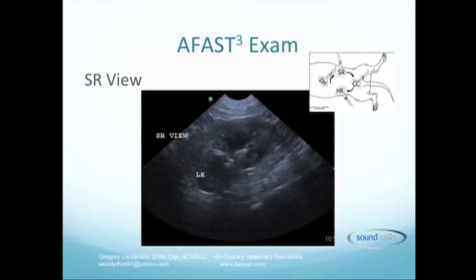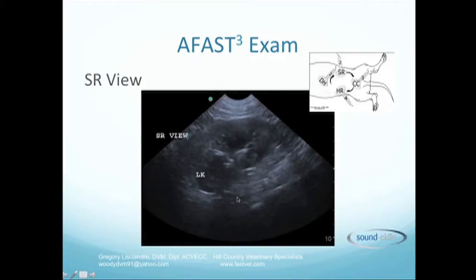Moving on, we go to the SR view. The SR view classically has the left kidney obtained as one of the target organs, and the spleen is also in that same area. By recognizing the kidney, the sonographer knows they have viewed a window into the retroperitoneal space — outside the abdominal cavity. By seeing the spleen in this region, the sonographer knows they have imaged into the abdominal cavity. The spleen is not readily apparent here in this still image.